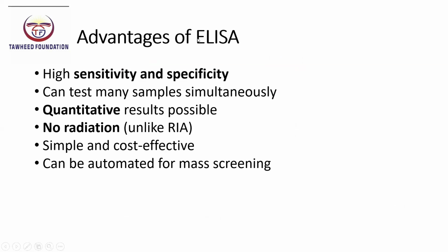High sensitivity and specificity. It can test many samples simultaneously. High throughput. Quantitative result is possible. No radiation unlike RIA. It is simple and cost effective, and it can be automated for mass screening.